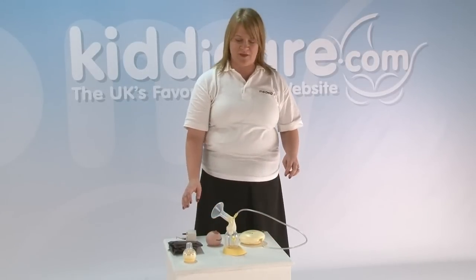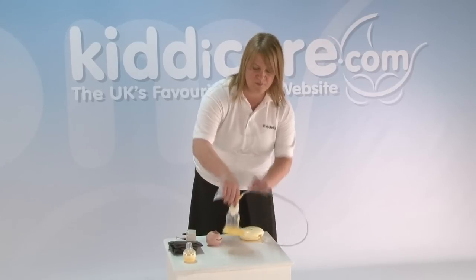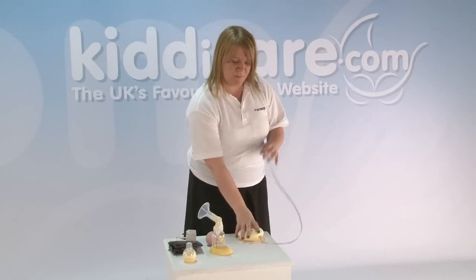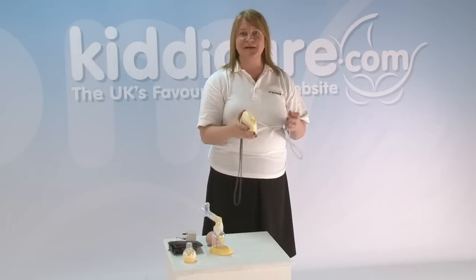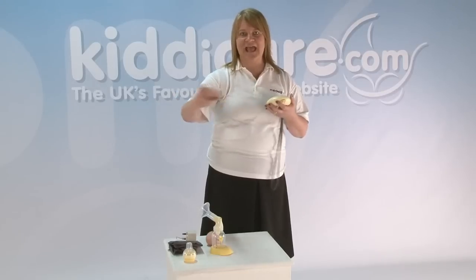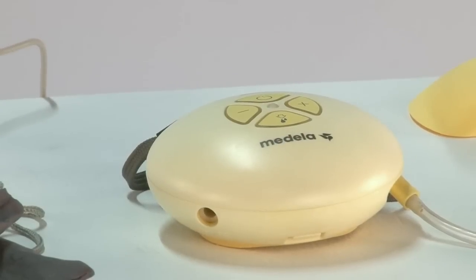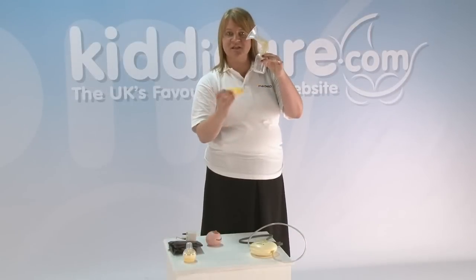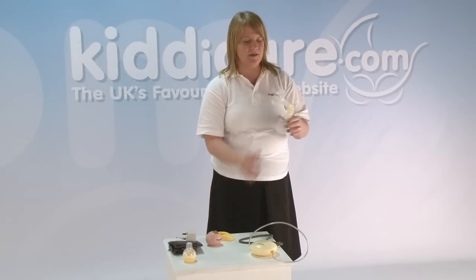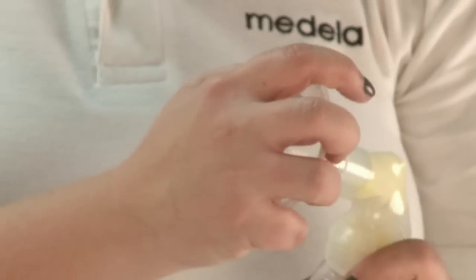To show you how the pump goes together, for cleaning you would need to pull the tubing from the bottle unit. This part obviously doesn't want to be submerged in water. We don't need to wash the tubing either because it's just air going down here, so keep these parts dry and to one side. You've got a stand just to make sure it's secure on the worktop — take that off, as that's not coming in contact with the milk either.